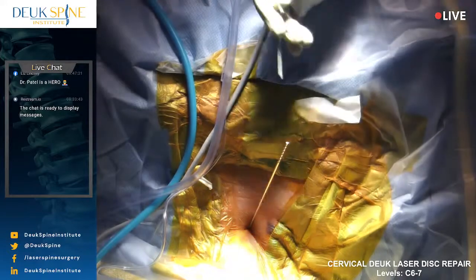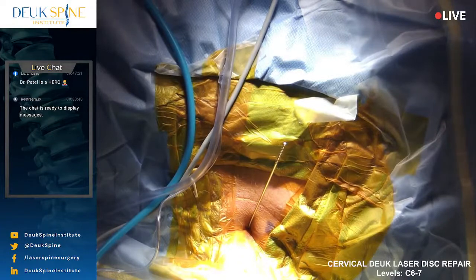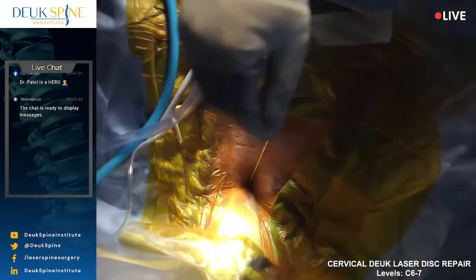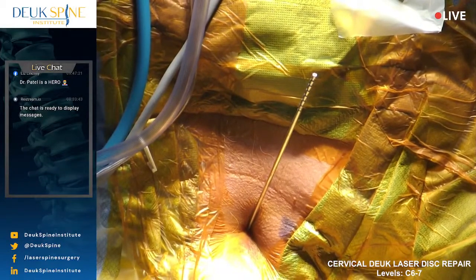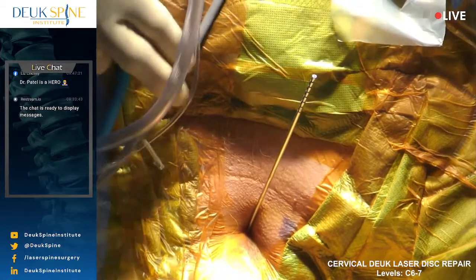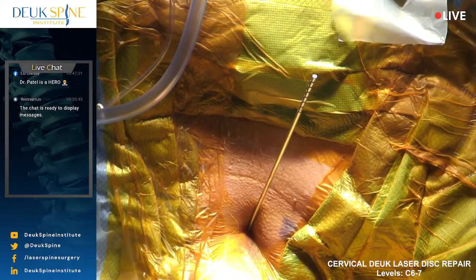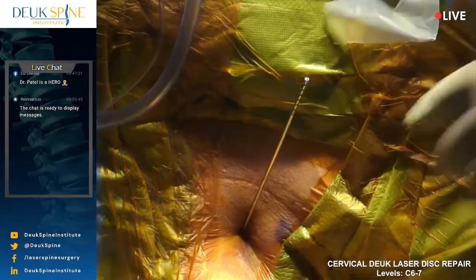So I did something unique here that I've not done in terms of specific technique. I was not able to gain access with the first disc with the needle because of the bone spur and the fact that the disc is so low and the shoulders are so big that visibility is somewhat poor but adequate. But I did get the needle just on a bone spur over the disc in the front of the disc, and I was able to then bring down the guide wire and the dilator after making an incision, and now we're inside the disc we need to fix.